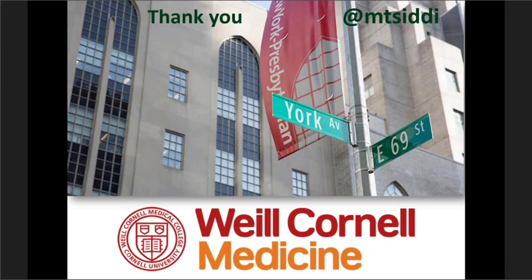Okay, I feel very comfortable in grading these tumors. I think we need to be promoters of grading, and for that, I think the work actually starts at the time of procurement and adequacy assessment, that our focus needs to be driven towards getting a good cell block, because that's the formalin-fixed tissue that has been validated for Ki67 indexing for our institution. So basically, that's what I would drive at. I would be very comfortable if I have quite a few groups of cells.